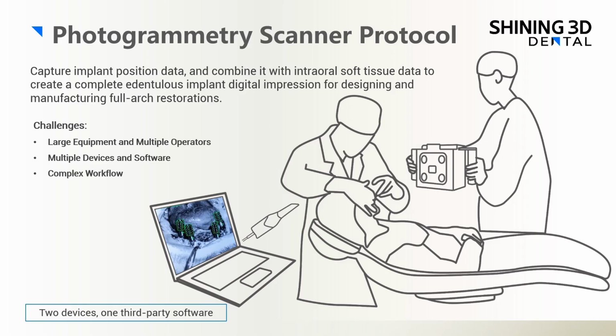The first one is that it is large equipment that needs multiple operators. It's bulky and difficult to maneuver. The second one is that multiple devices and software are needed in this whole process. Not only the extraoral photogrammetry device, but also you need an intraoral scanner to capture the soft tissue data, and then it causes the third challenge, which is a complex workflow, because you have to use third-party software to combine the data from these two different devices and align them in the third-party software.